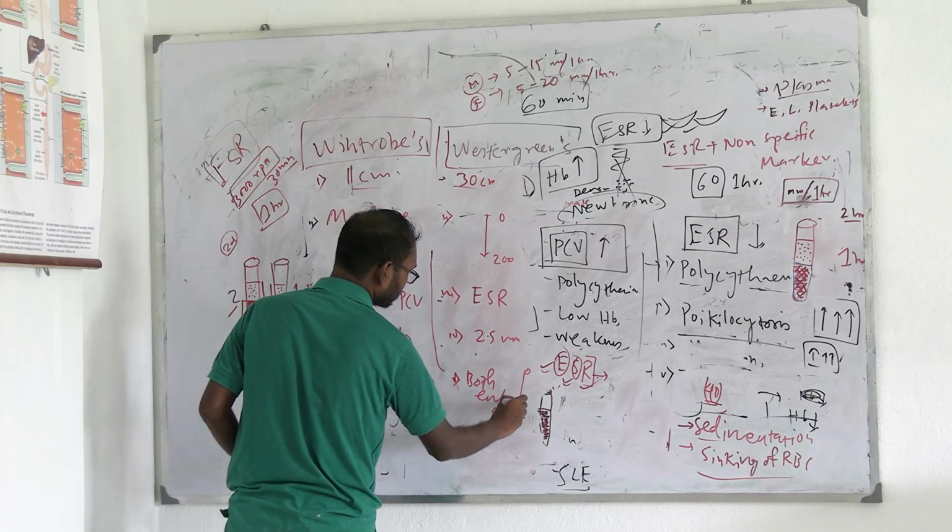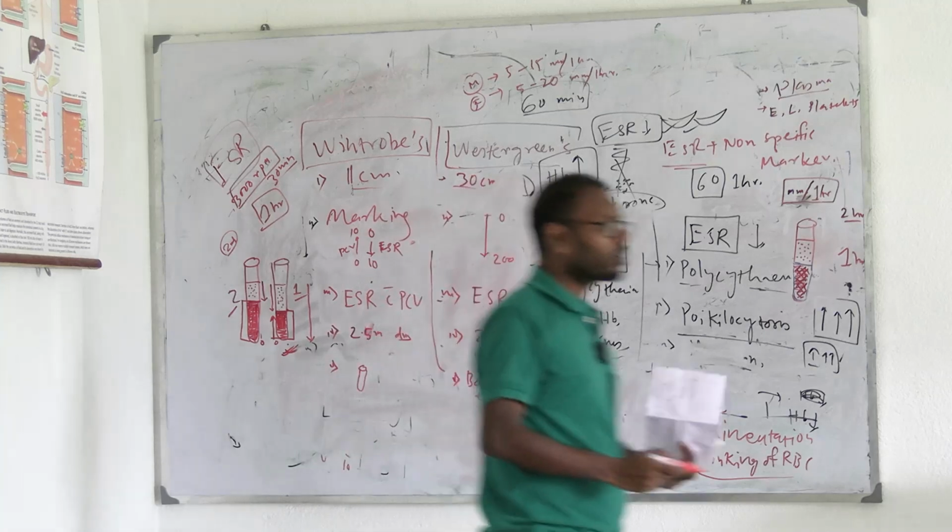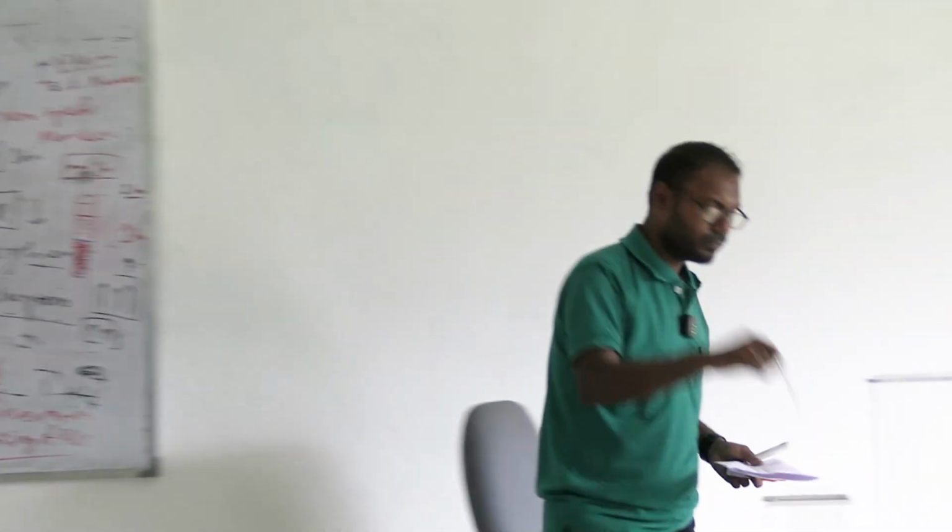Okay, তো এরকম। Now you will ask কোথায় স্যার নেই তো? Okay, let me show you. দেখো, these have one end open. So এটা আমার কি টিউব? Wintrobe's tube, ছোট 11 সেমি.